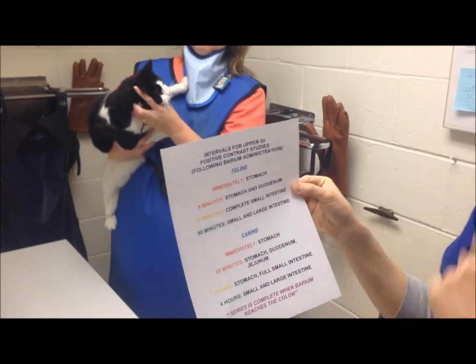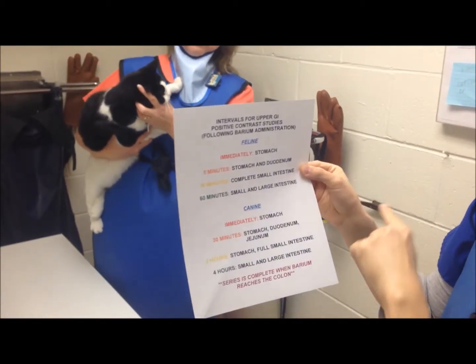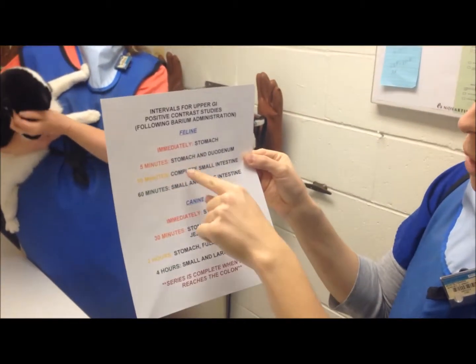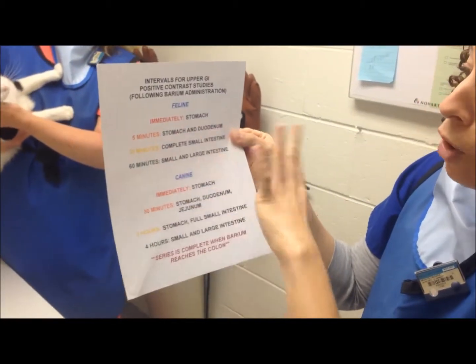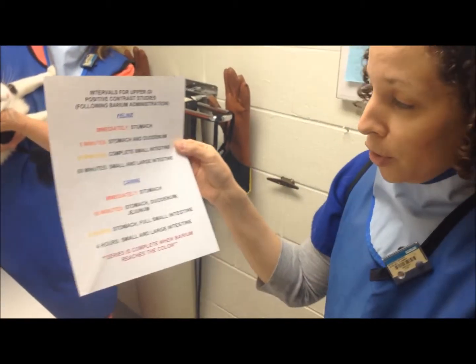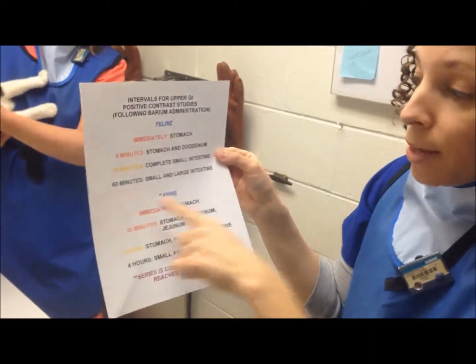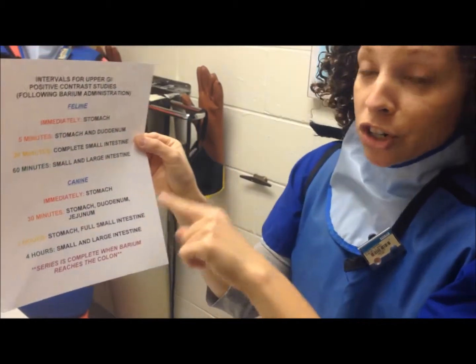So again, immediately we'll get her stomach for the study. 5 minutes after that, we'll take just a lateral and a VD, and then we'll be able to visualize her stomach and her duodenum. And then roughly 30 minutes after we administer the barium, we'll get her complete small intestine. And then 60 minutes after the barium has been administered, we should get the small and the large intestine.